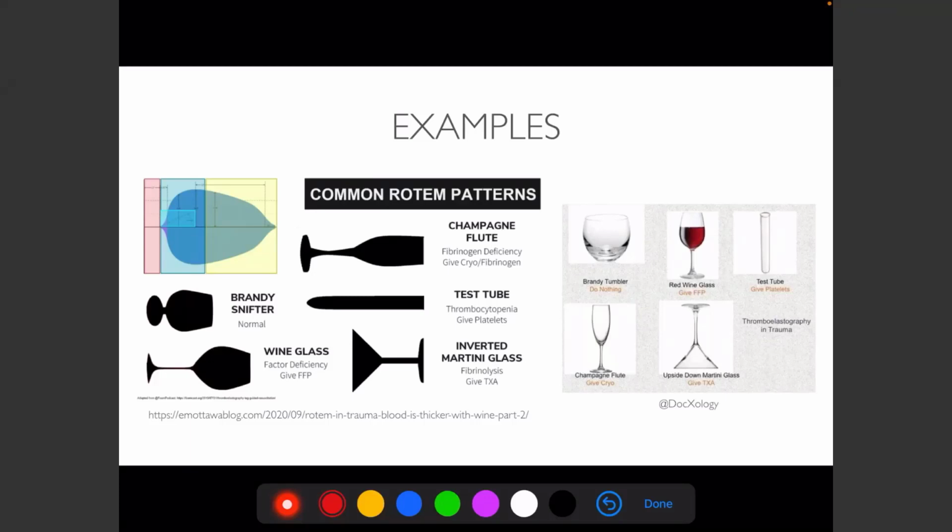At least for that. No, we've had trials, not using Rotem, but you've had trials to look at whether or not you administer platelets. And I just wonder, in a context of Rotem, if you're using Rotem to say whether or not you get DDAVP or not. Yeah, because I don't know if there's even data on Rotem in intracranial hemorrhage. I didn't find any. So you would have to do that. I don't know. But hopefully there would be, because I think that's one of the areas with big utility.